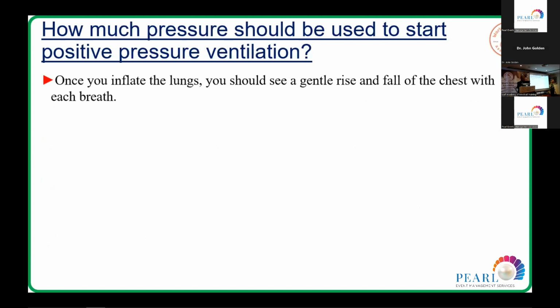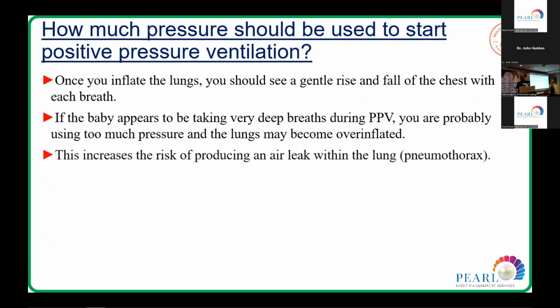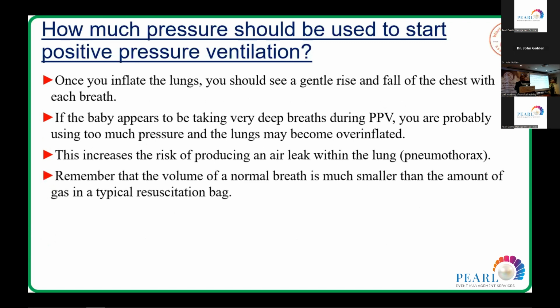Once you inflate the lung, you should see a gentle rise and fall of the chest with each breath. If the baby appears to be taking very deep breaths during PPV, you are probably using too much pressure and the lungs may become overinflated. This increases the risk of producing an air leak within the lung, a pneumothorax. Remember that the volume of a neonatal breath is much smaller than the amount of gas in the typical resuscitation bag.